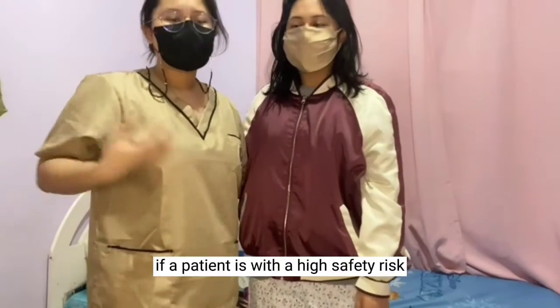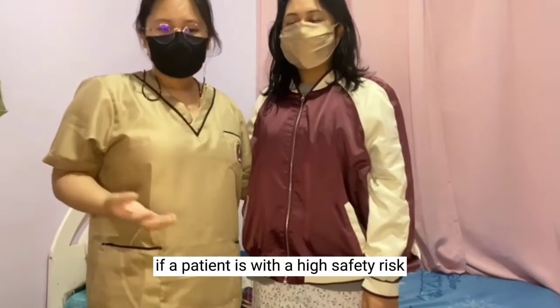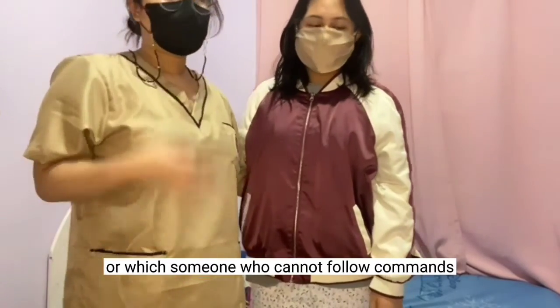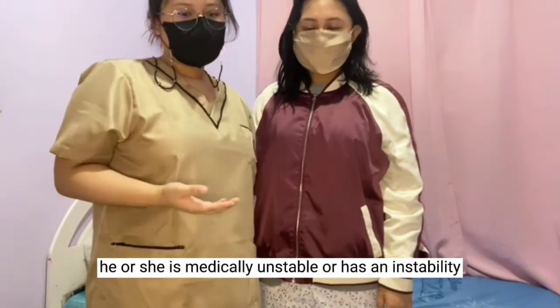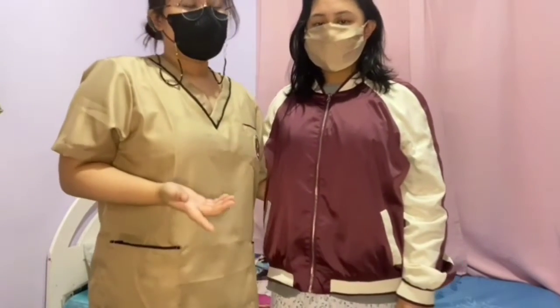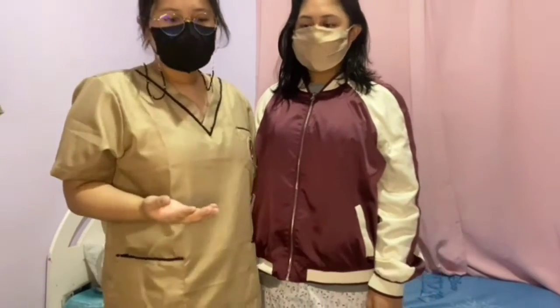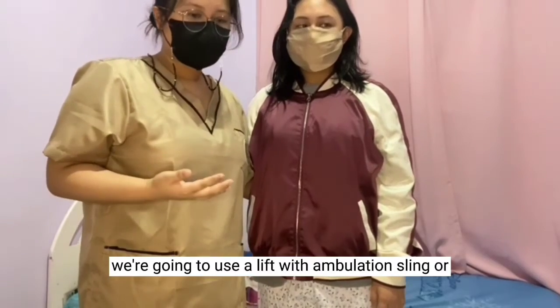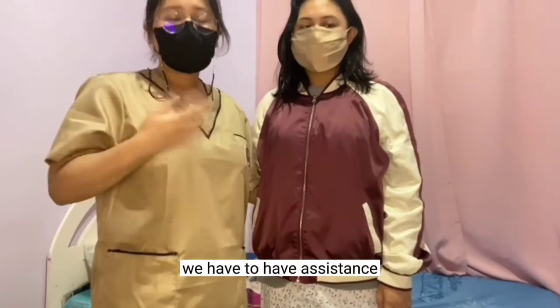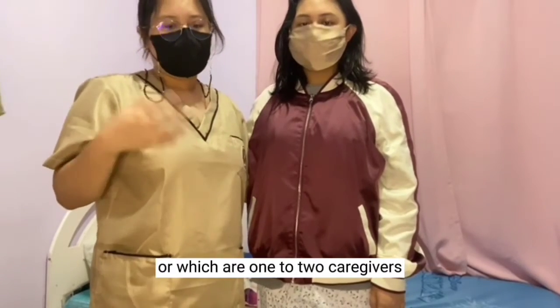So for example, if a patient is with a high safety risk, someone who cannot follow commands, is medically unstable, or lacks experience with assistive devices, we're going to use a lift with ambulation sling, or we have to have assistants, which are 1 to 2 caregivers.